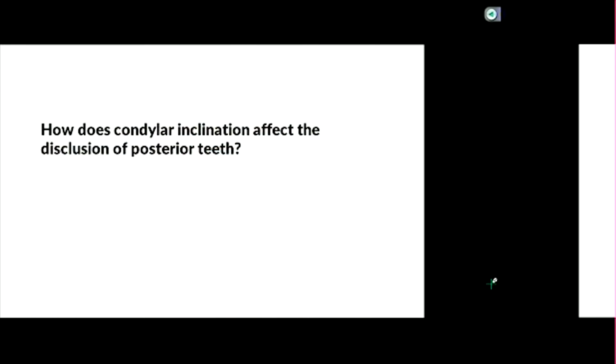If you have your cast on your articulator, and hopefully you have enough, is there a group of three that doesn't have one that they can share? Once you all pick up your articulator, you can share. Do you need one? This is what you're going to do.